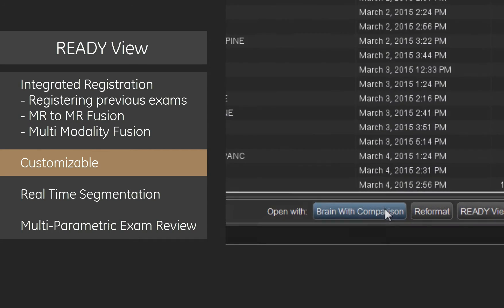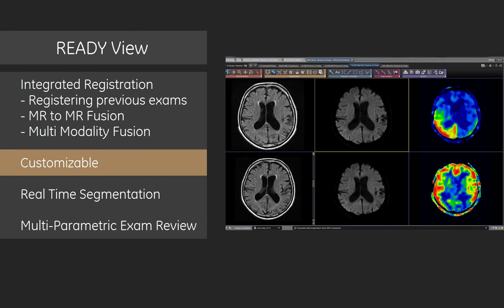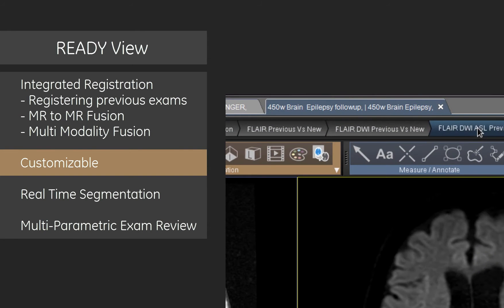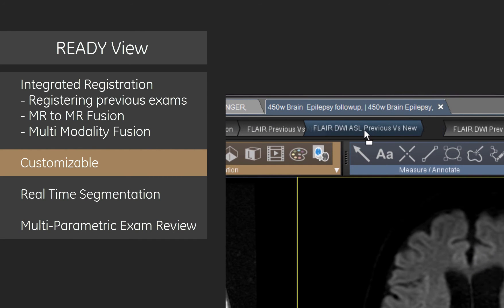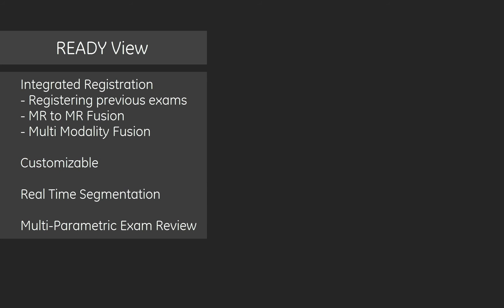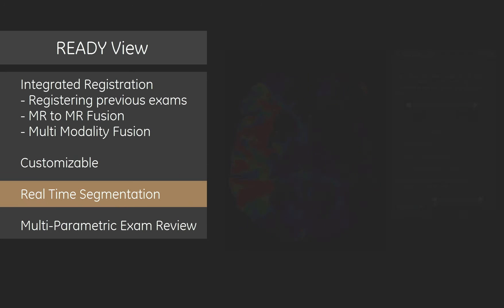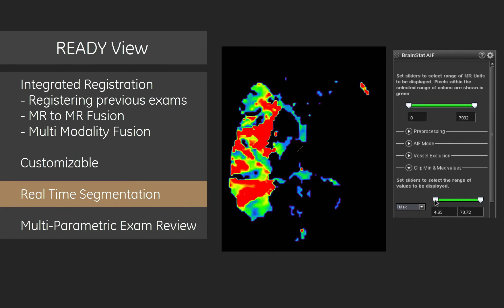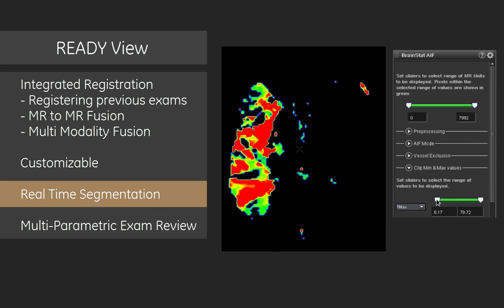ReadyView was designed to improve your productivity by standardizing exams and decreasing post-processing time. Tools like real-time segmentation allow you to fine-tune regions of interest and provide quantifiable data.